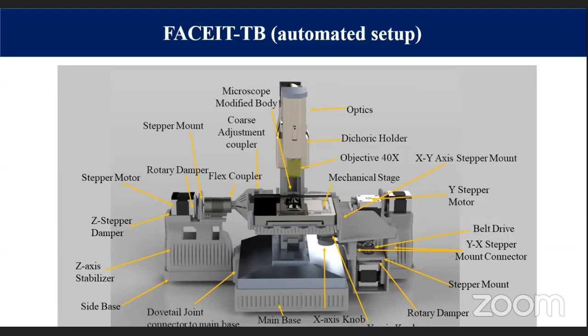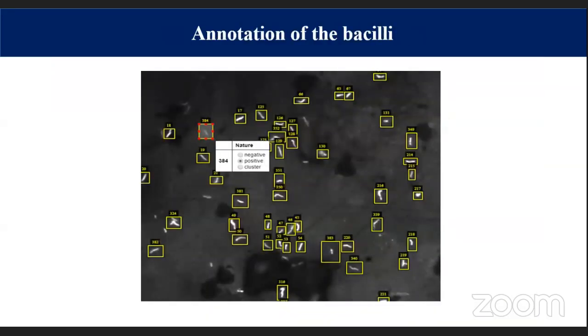All the data can be processed over there, and the end result, whether a certain number of bacilli are present in each field of view or not, is sent back to the observer as an SMS or picture message.